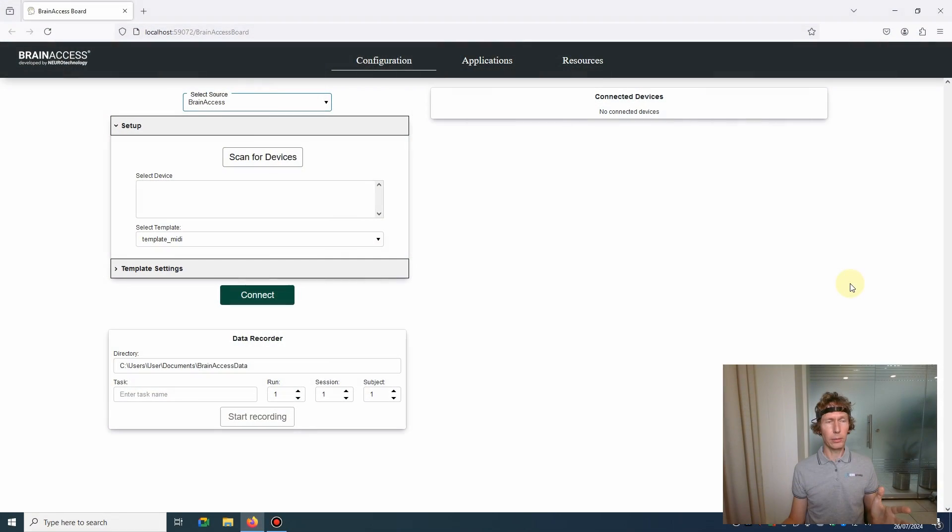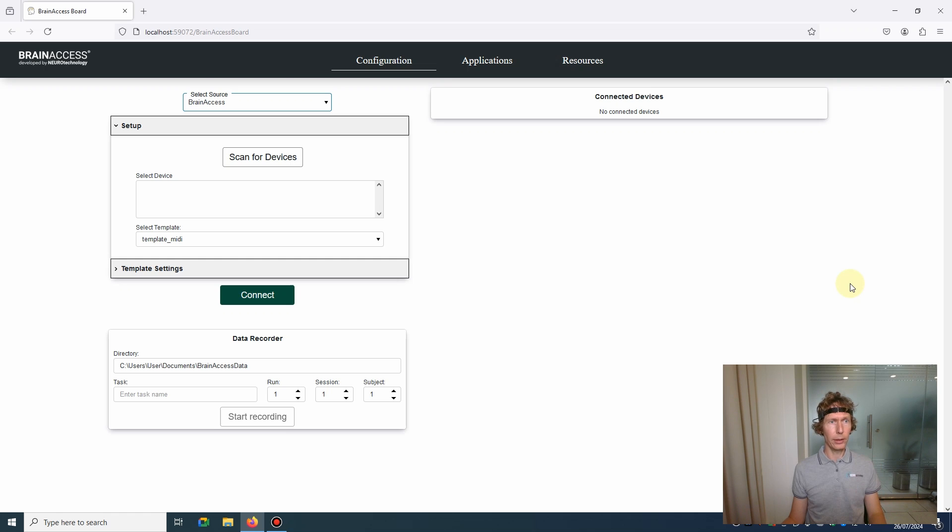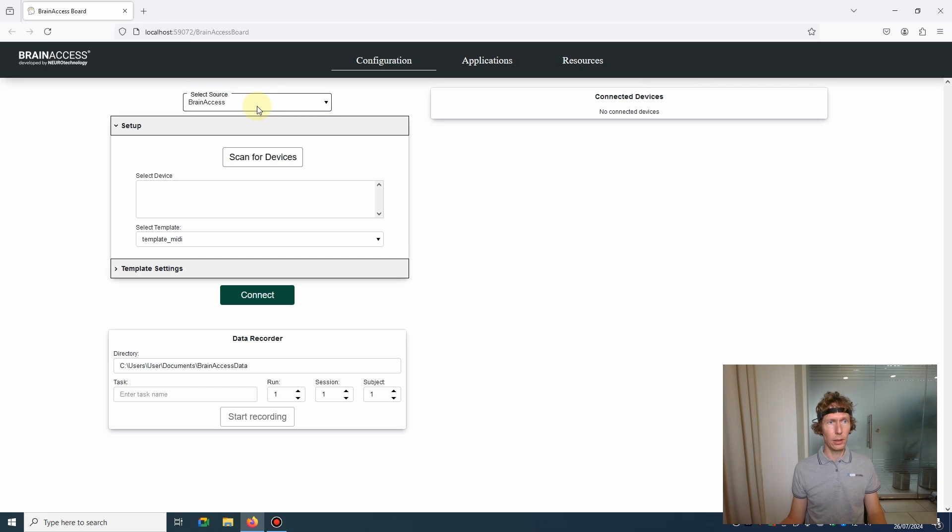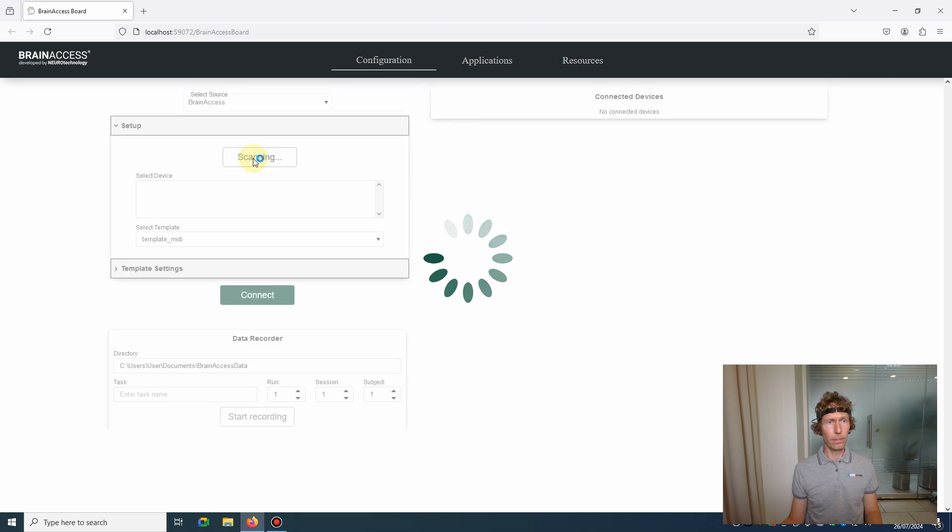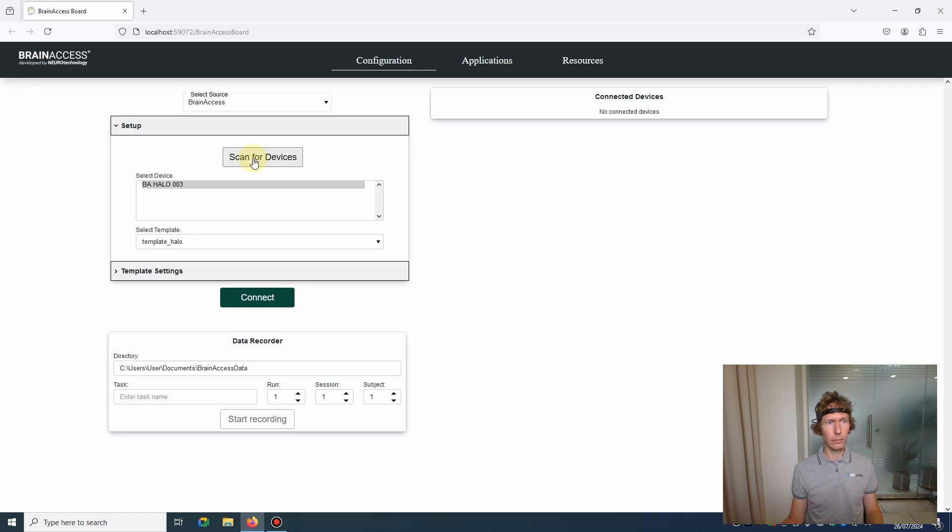Now let me show you how to connect to Brain Access Halo device using Brain Access Board software. This is the main window of the board. Select Brain Access as the source, do the scan. After the scanning, we'll see all the available devices.